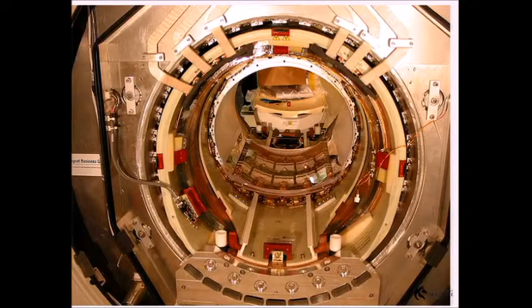That's a picture of an MR system taken from the back end with all the covers removed. So where you see this weld here is basically the bore of the magnet when it exits the manufacturer. There's a couple of companies that make magnets, and then they ship them to the 3 main manufacturers around the world, which would be GE, Philips and Siemens. So the magnets are made by another company. Typically there's 2, but Oxford Instruments, for instance, makes them in the UK and then ships them to Siemens in Germany, Philips in the Netherlands, or GE in the States.